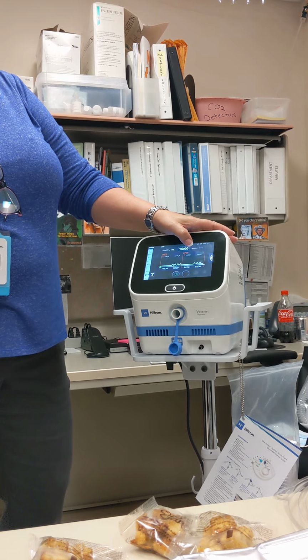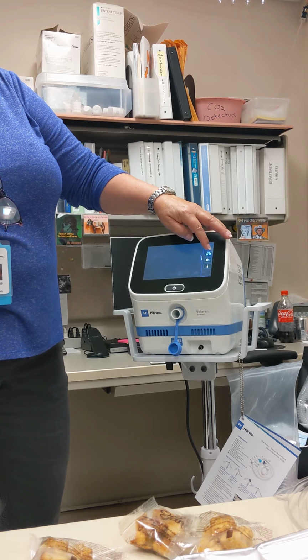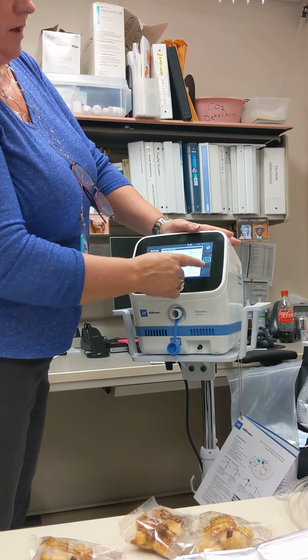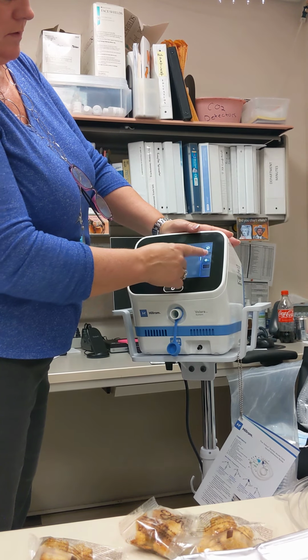Was the advice they used to change this, because we can't take the neb kit off in the automatic mode, so it runs. Yeah, well, you have no access in the automatic mode. Clinical access, you can do everything. No, we do not have clinical access.